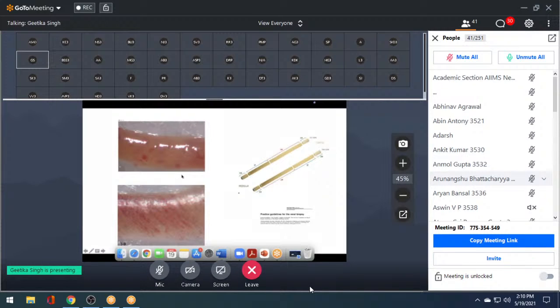So we can see it in an unfixed, unstained tissue. That's just the core. It's the fresh core which has just come out of the patient's body. And on the other hand, if you see these parallel sort of rays, this is the look of the medulla. Now, it's very important when we are suspecting glomerular disease that you, of course, need glomeruli.